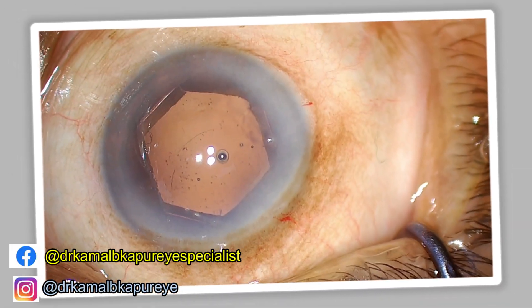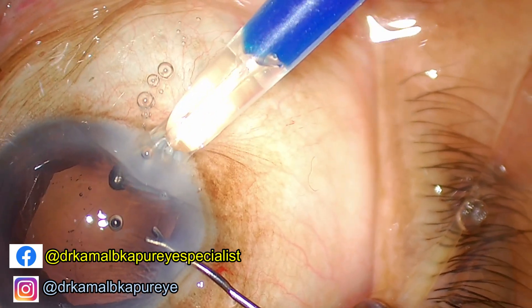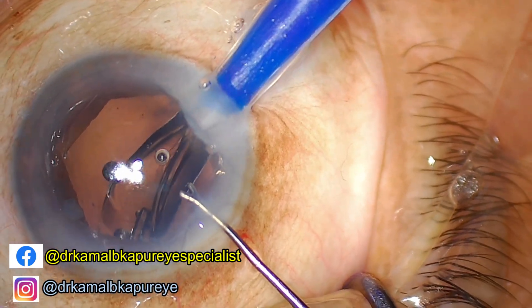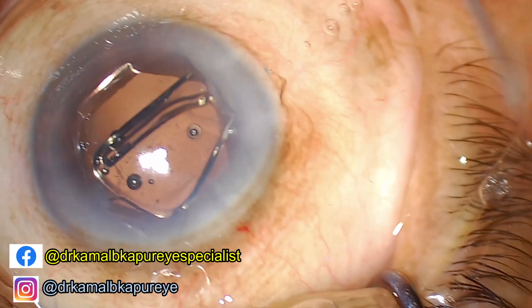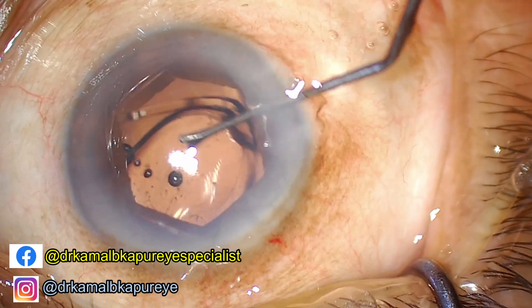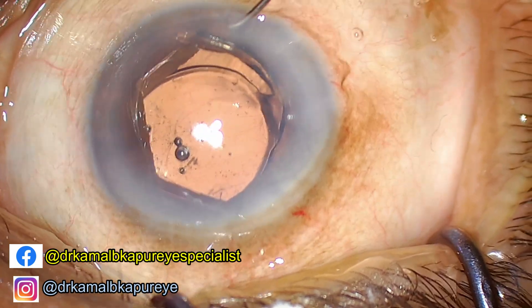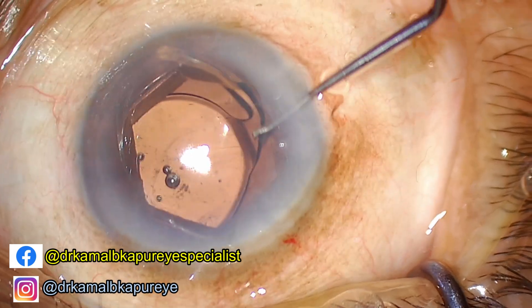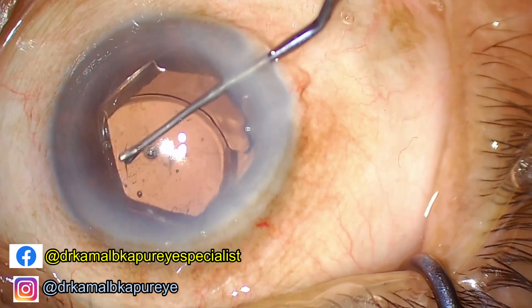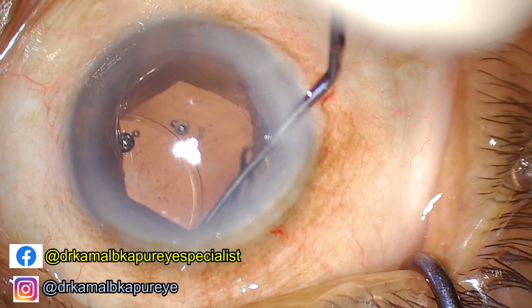I am proceeding to put a trifocal lens in this patient. You need to remember that the rhexis is oval, so try and implant the lens before the haptic opens. I am waiting for the haptic to just settle down — the haptic has still not opened. My endeavor here is to roll the haptic into the capsular bag before it opens completely because I have a very small rhexis. Trying to push in a completely open haptic with weak zonules and a very small rhexis could have been tricky.